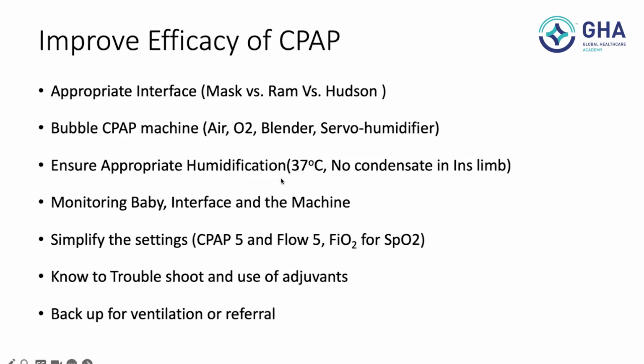Always think of the troubleshoots. Some of them we will try to discuss in the next slide. And always use adjuvants like surfactant, caffeine, feeding, colostrum, and developmental supportive care. This should be part of CPAP care. Backup ventilation should be available if you are doing only CPAP in your units, or have some tie-up with a tertiary care unit so that if the baby fails, you can shift the baby to higher centers.